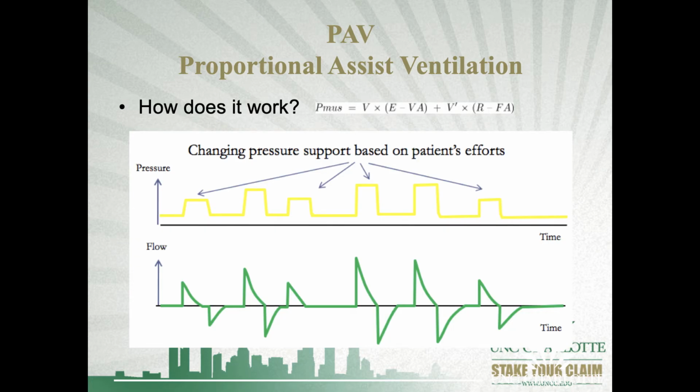This is what the waveform kind of looks like, and it looks almost just like any other pressure support waveform. You see the patient taking different flow rates in as far as their spontaneous breaths. You see our pressure is held constant here, so we know this is a pressure mode of ventilation. But how it works really is based off the equation of motion, right? So the equation of motion states that the volume and elastance are directly proportional to flow and resistance.